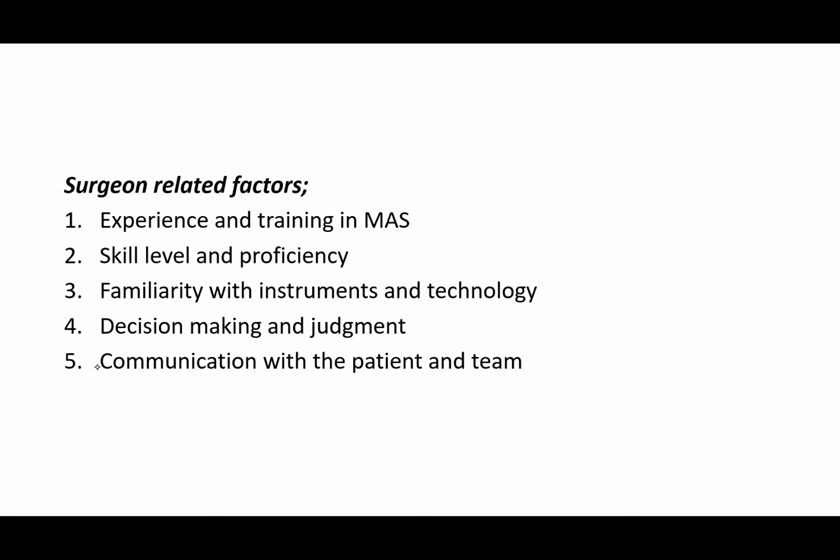Now, it is very important you go through the basic laparoscopic surgery training, which we just commenced, starting with the principles and foundation, then training using endo trainers or simulators before going into live patients.